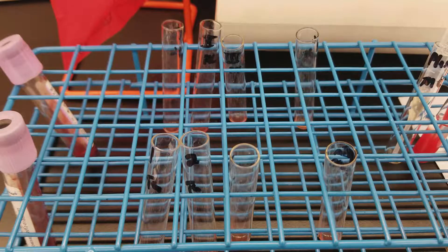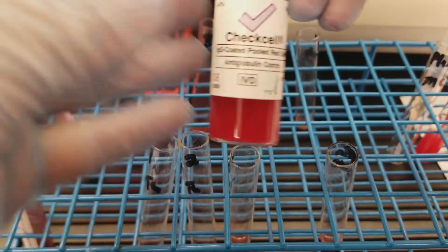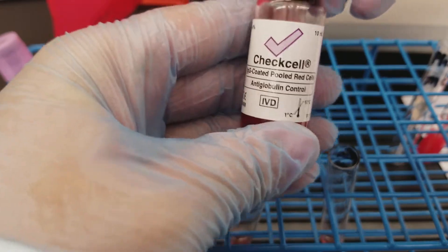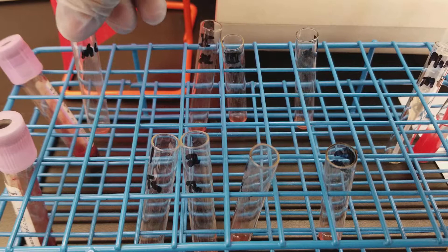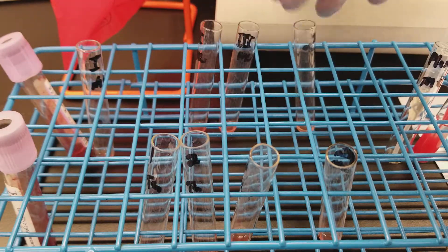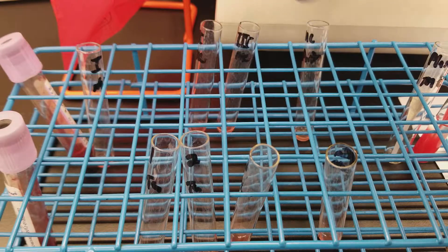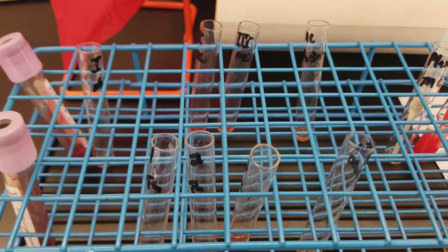Welcome back to the check cell portion of the antibody screen. I'm going to add the check cells now to only the negative ones. The patient in the back had a positive first tube, so I'm going to take that away so I don't accidentally add to it. All of these others were negative, so we're going to add the cells only to the reaction tubes that were negative.